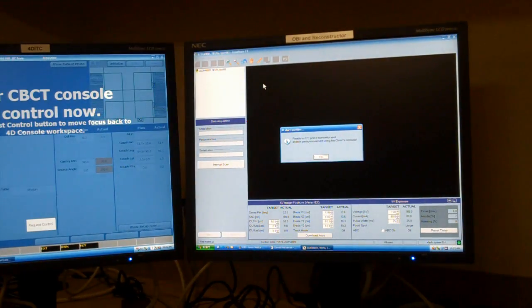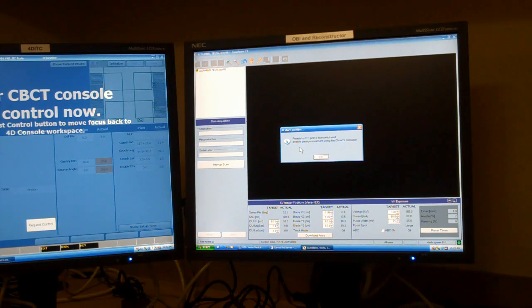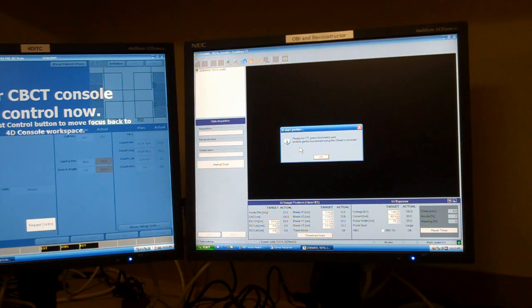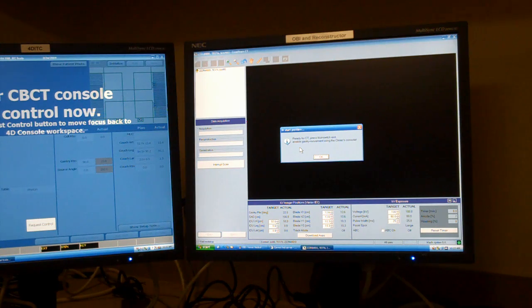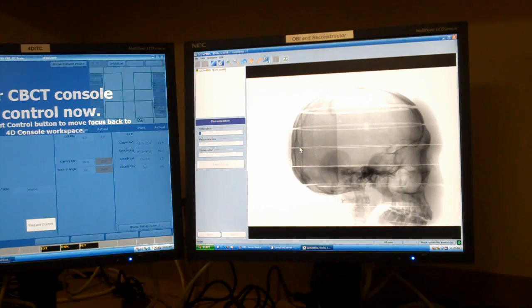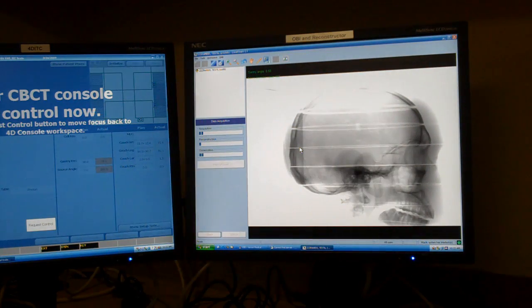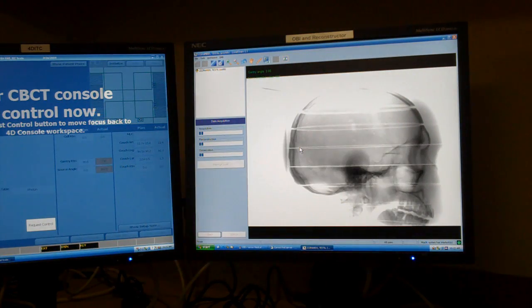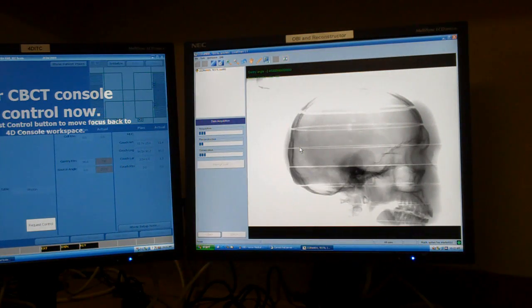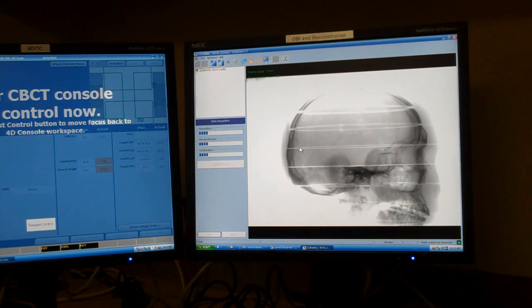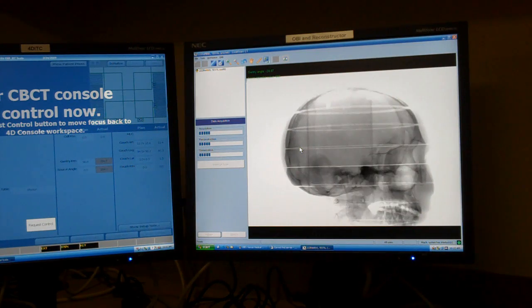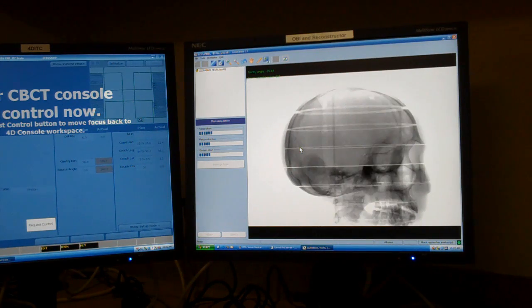The OBI workstation now tells me ready to CT, press Foot Switch, and Enable Gantry Movement. So I'm going to hold down the foot switch or the finger and push Motion Enable and go, and you can see it's now taking a Cone Beam CT of the Rando Phantom.